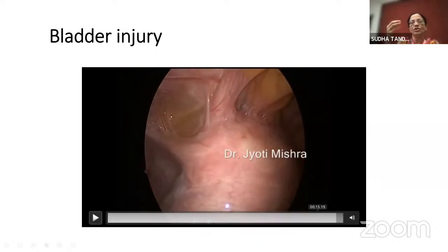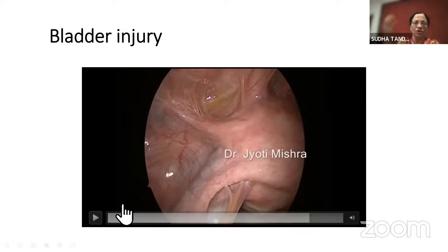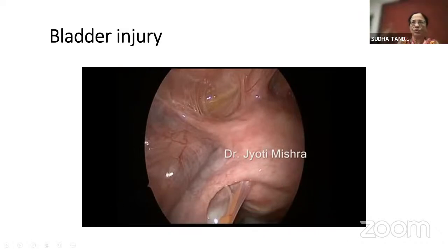And then once you are very sure that you can delineate the bladder, you can fill the bladder, as I think Aarti has already told you. Filling really helps. I don't know whether she told you, but you can fill it with about 100 ml of saline, with a little methylene blue. So that also will give you some sort of upper border.